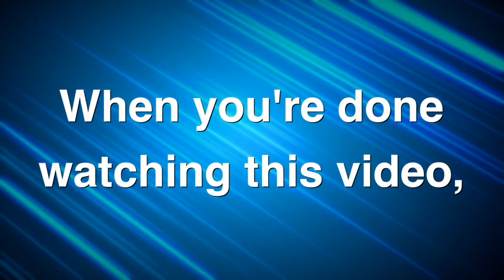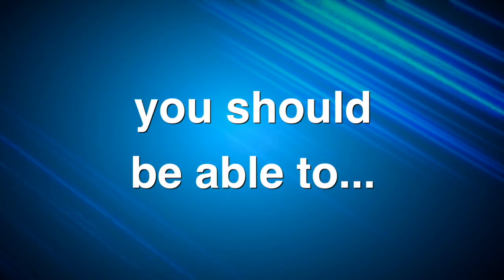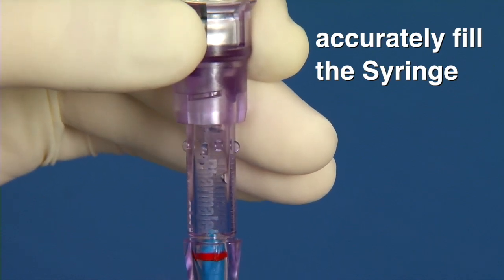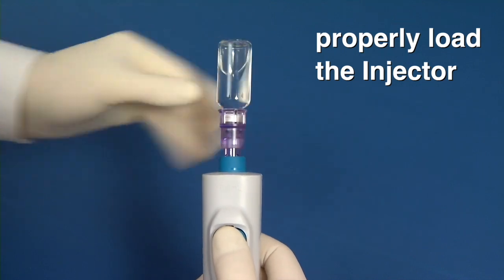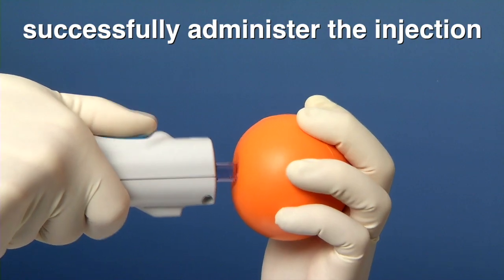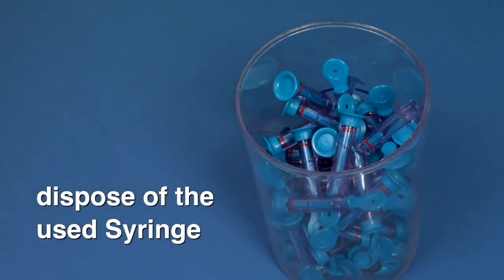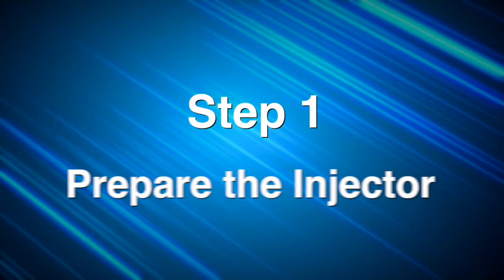When you are done with this video, you should be able to properly prepare the injector, accurately fill the syringe, properly load the injector with the filled syringe, successfully administer the injection to the patient, and dispose of the used syringe. Step 1. Prepare the injector.